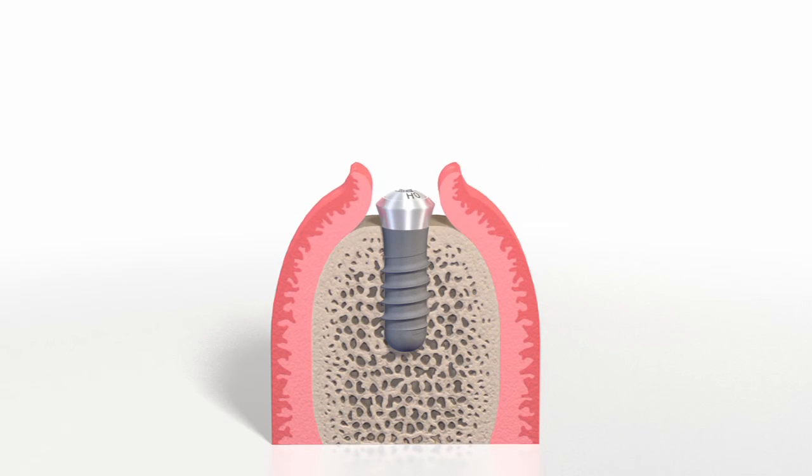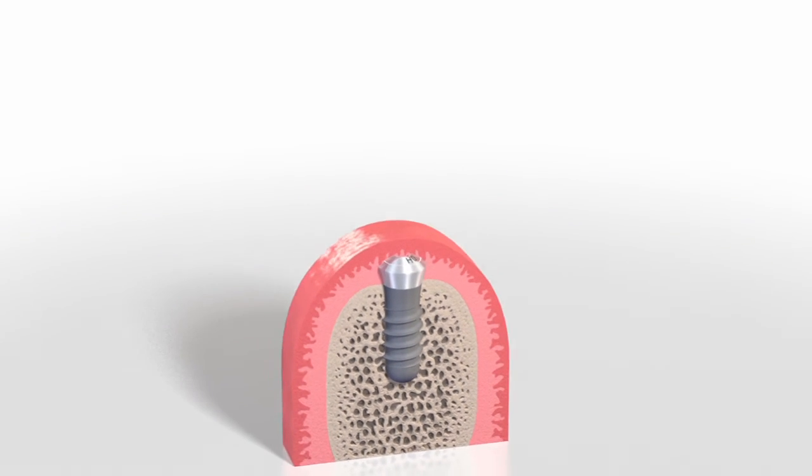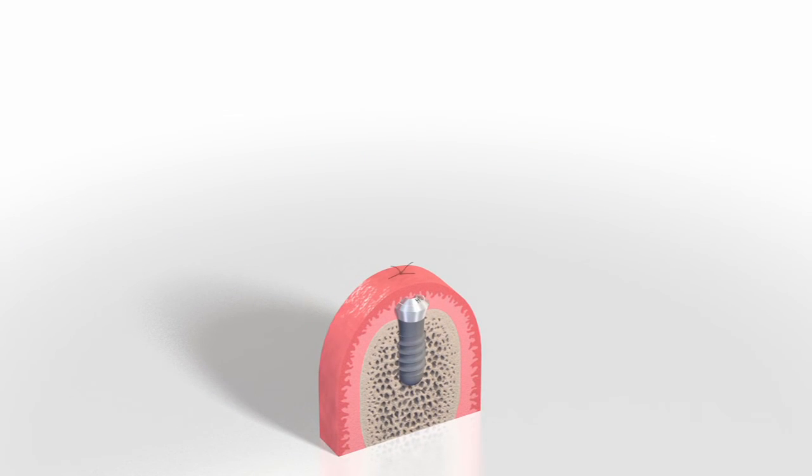The mucoperiosteal flaps must be adapted carefully and sutured together with interrupted sutures. The result should be a tight seal over the implant.